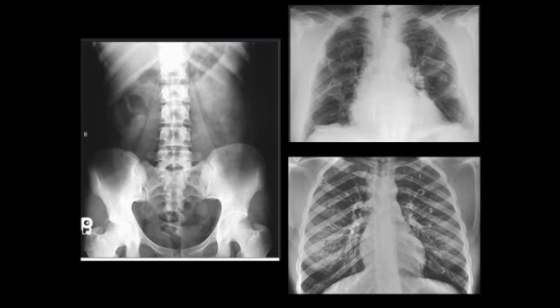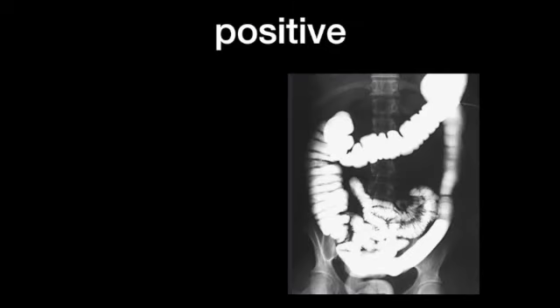So this is where contrast media helps us out. Now, we can add positive contrast agents, which are radiopaque. Those are going to absorb the X-rays. That's going to show up as white on our image. So if you look at this abdomen X-ray here, this person has drank barium sulfate. Barium is a heavy metal. It's got an atomic number of 56, which is high compared to the surrounding structures.